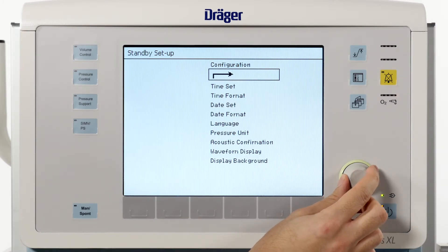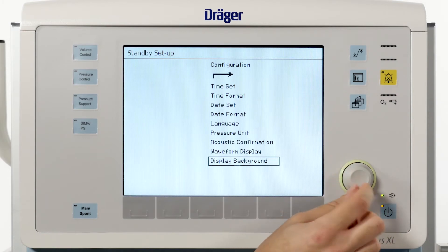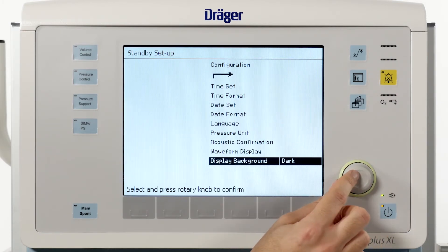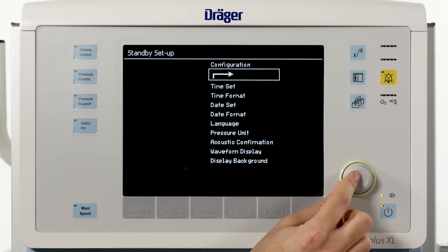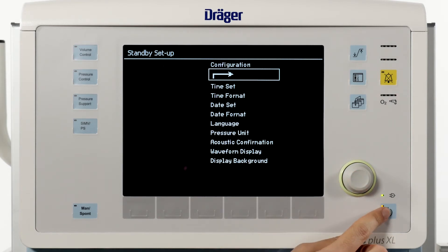For minimal invasive surgery when the OR lights are dimmed, you can set your display to dark mode under the menu point display background.